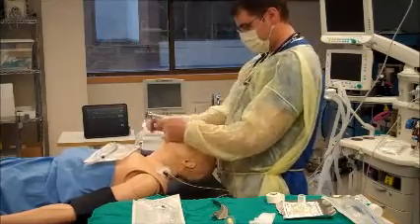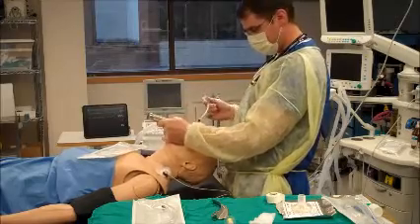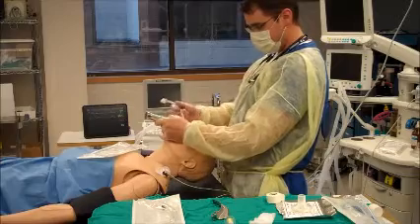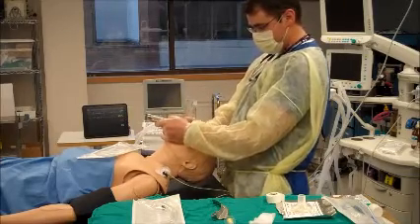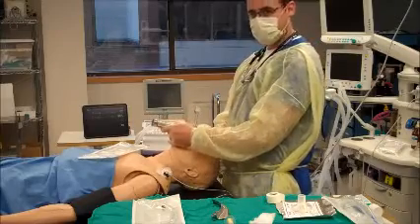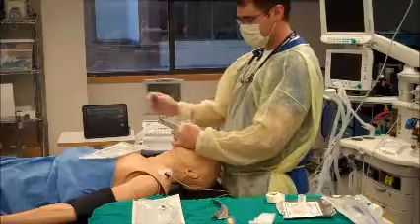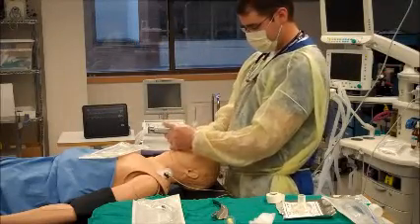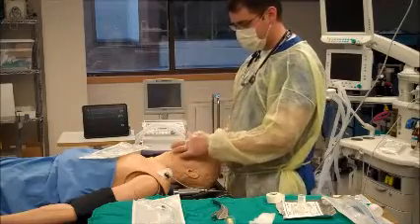Once I see the vallecula space, I'm going to get into it and apply some anterior pressure. The second I see the arytenoids and glottis, I'm not taking my eyes off of it. I'm going to introduce the tube from the same angle as the laryngoscope. As soon as the tip of the tube gets through the cords, that's when I ask my assistant to pull the stylet. As they're pulling the stylet, I'm inserting it to a depth that feels satisfactory, so the black line is through the cords.